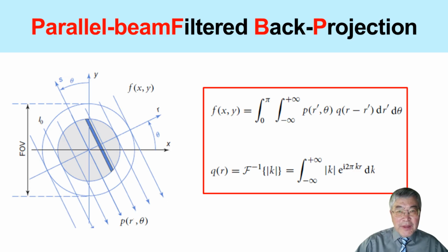So parallel beam CT can be understood as a Fourier imaging method. The projection data give us Fourier domain information through the Fourier slice theorem, and filtered backprojection gives us a practical way to bring that information back into the image domain. That is the key idea behind the parallel beam filtered backprojection method.